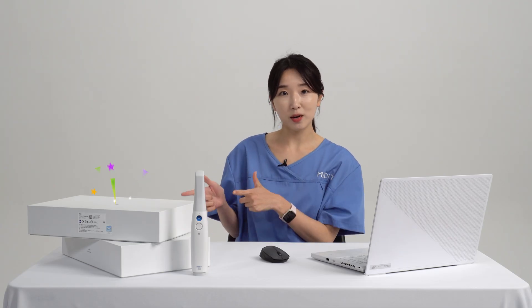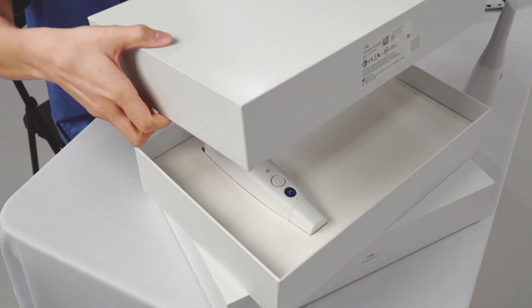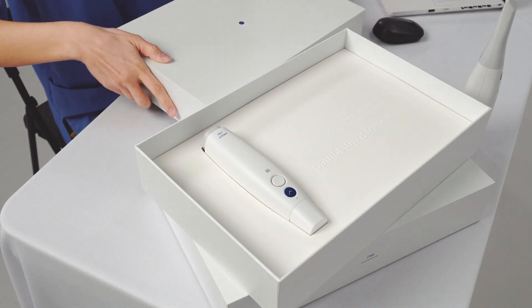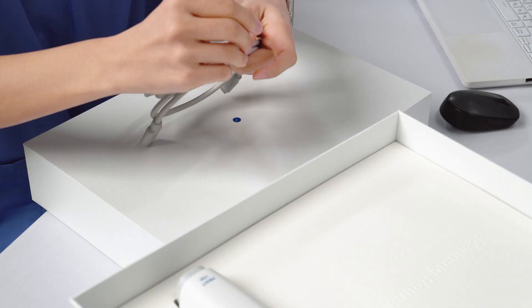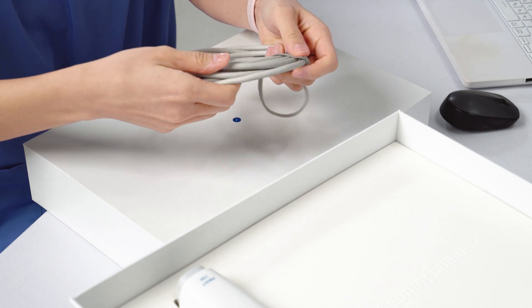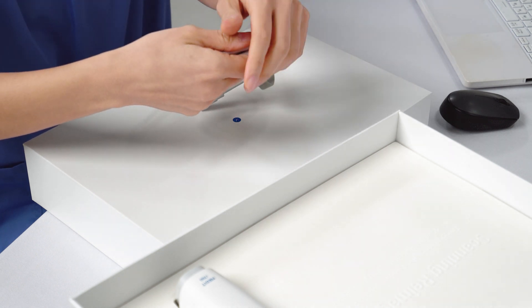Next, let's get our scanner ready! There are a bunch of things in the box, but we're just going to get the scanner, the scanner tip, and the power delivery cable.